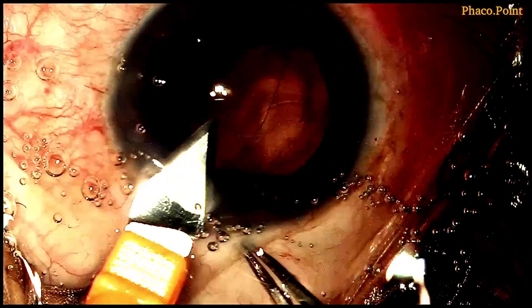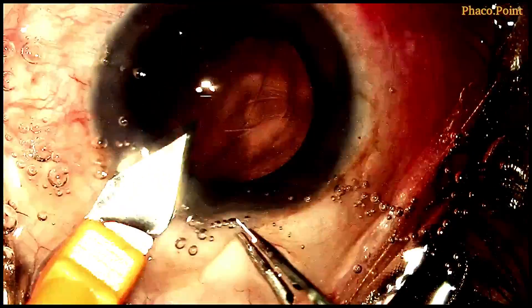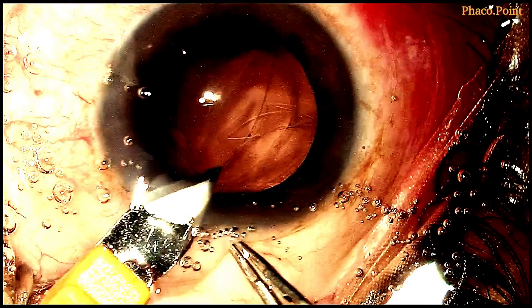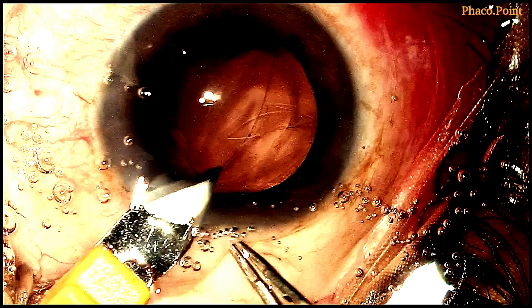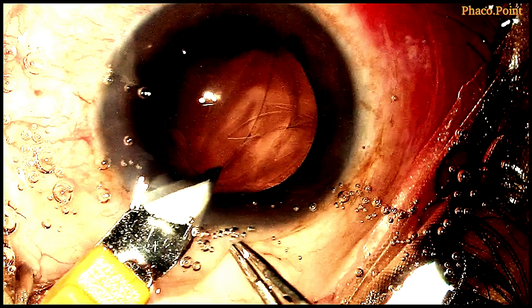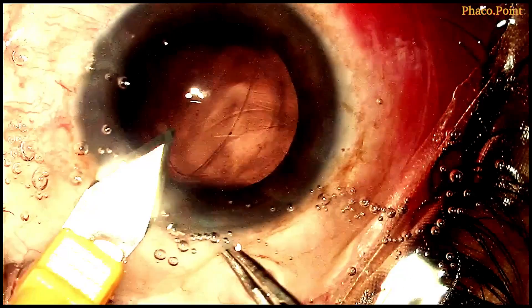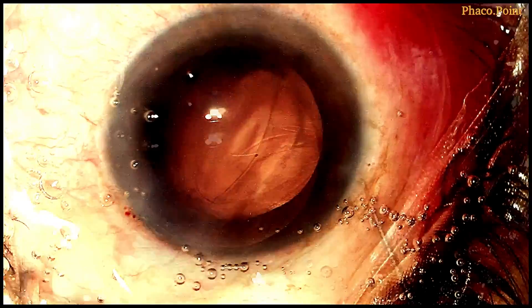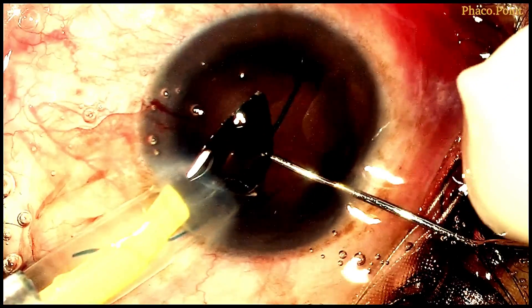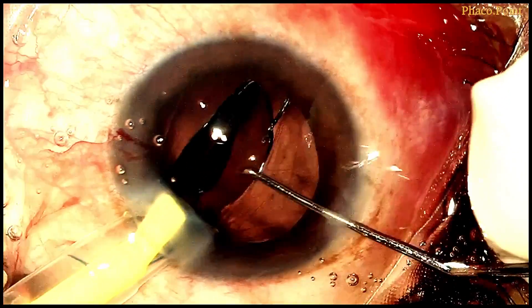Let's now move to the IOL implantation. The first step is the enlargement of the incision to about 3.4 millimeters. You need a large enough incision to allow the nozzle to enter significantly into the anterior chamber.